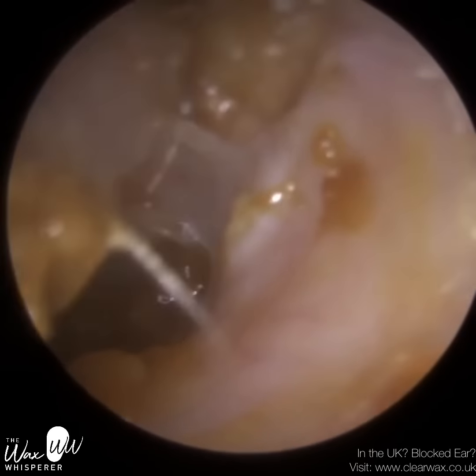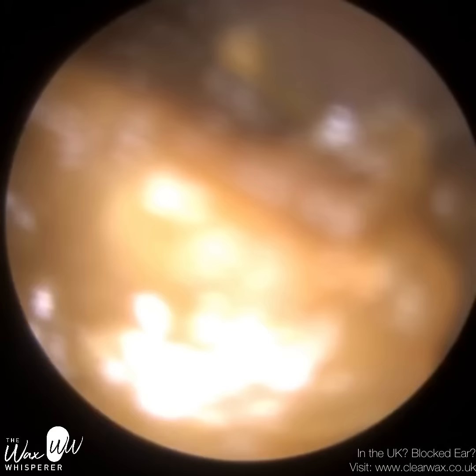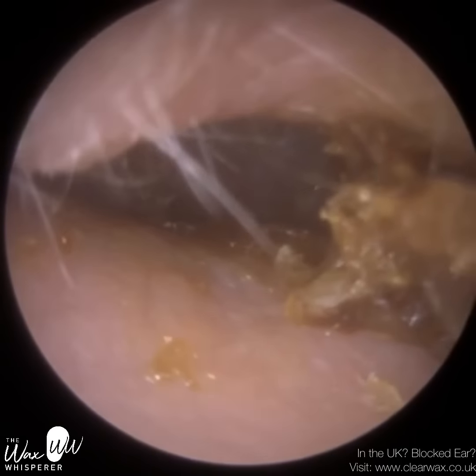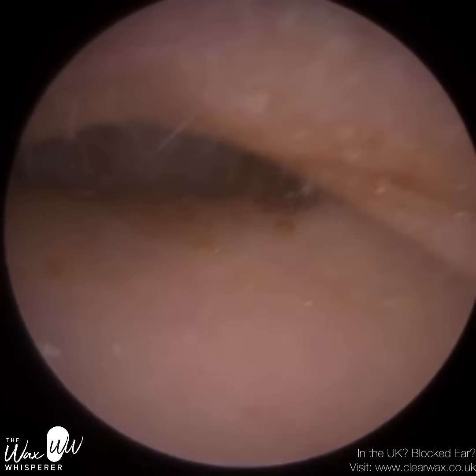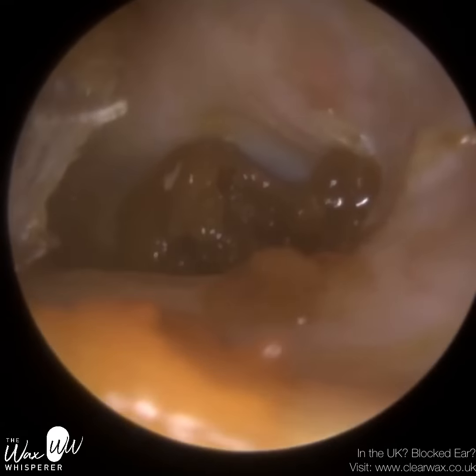And we've also, hopefully, it's hard to know whether that perforation will heal. It's so small, so potentially it can, but the main idea now is to keep that perforation dry. I appreciate I've talked a lot about that, but I've not talked much about this left ear, so I'm just going to come back to this left ear.